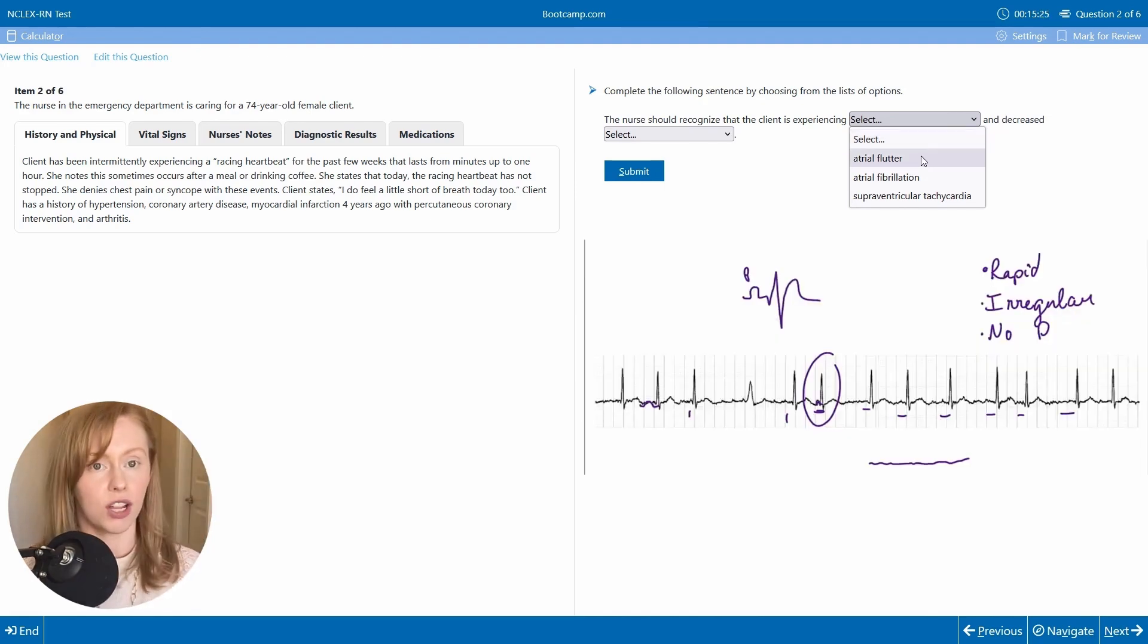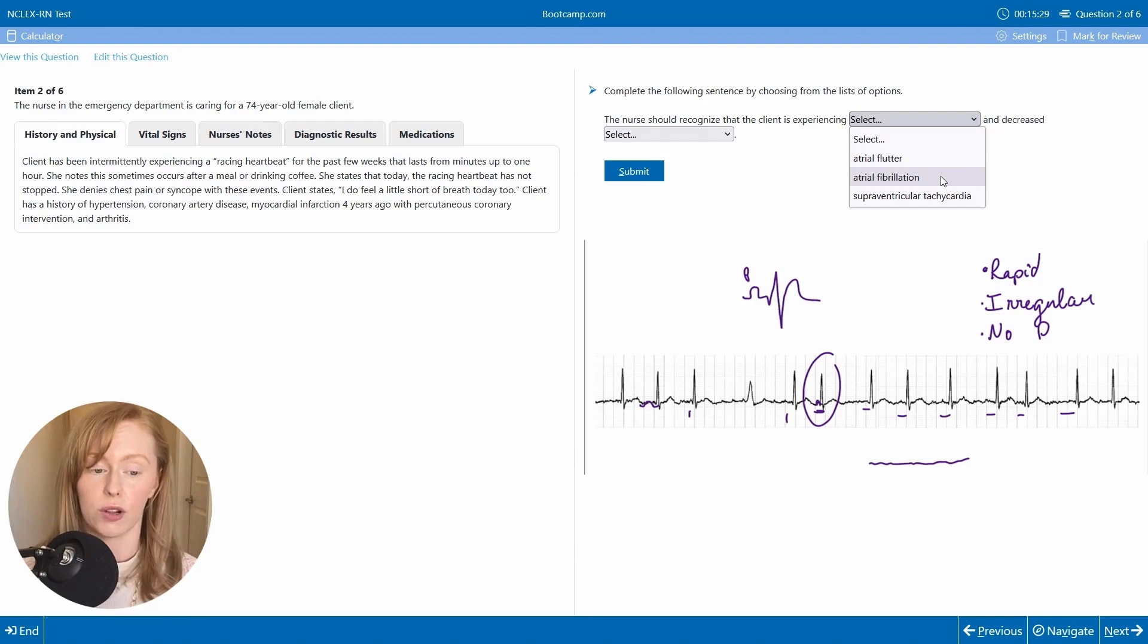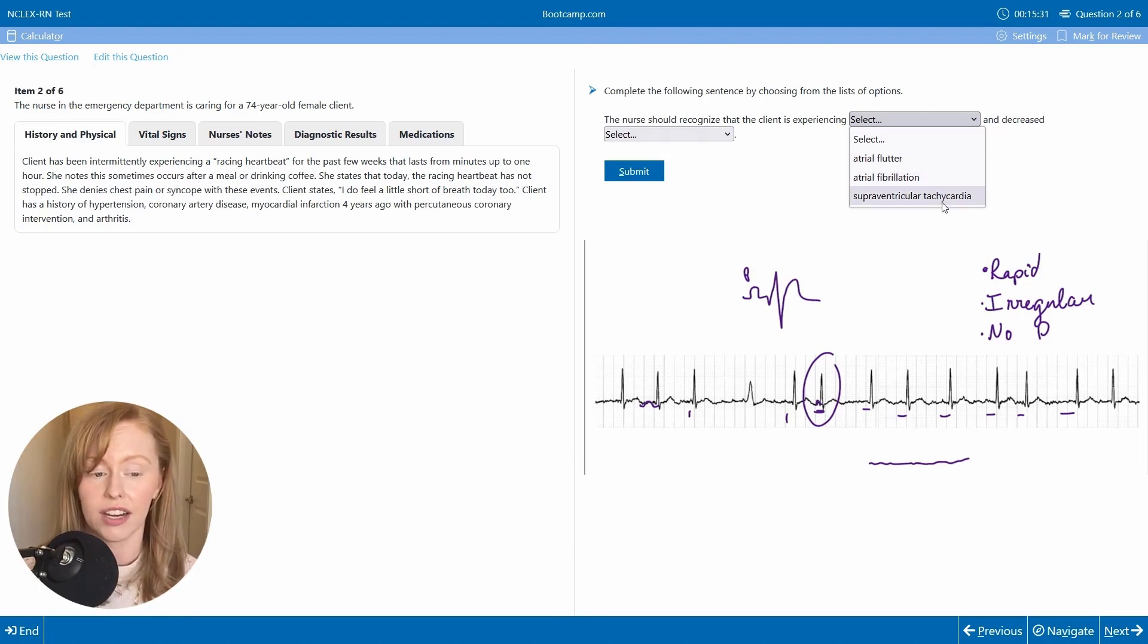So I don't have flutter waves. I don't think it's an atrial flutter. I think I have fibrillatory waves. So it might be an atrial fibrillation.